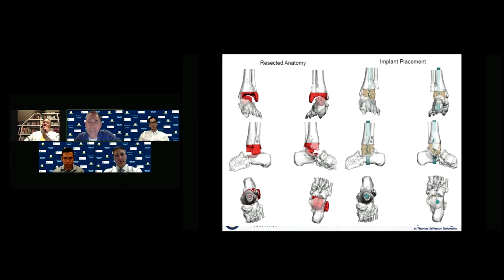Do you make sure that when you're getting these drawings made up for you, there are additional options like being able to put screws through that cage? That's an option now. As I've gotten more savvy with these cages I've designed in my implants, for instance, most recently I had a discussion with the Additive Orthopedics engineer where you can have divergent screws to put into the tibia or calcaneus to hold the position, but I still think you need some form of load sharing device, such as a nail. I wouldn't rely solely on those screws.